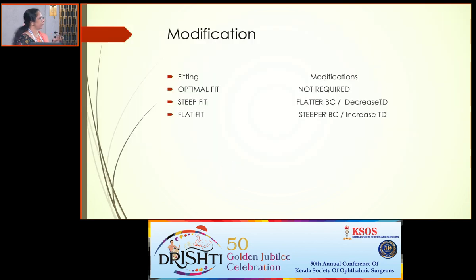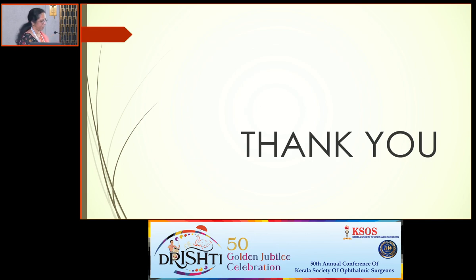Accordingly, based on the trial you have done, you can modify the prescription. If it's an optimal fit, no modification is required. For a steep fit, you order a flatter base curve, and for a flat fit, a steeper base curve can be ordered. Thank you.